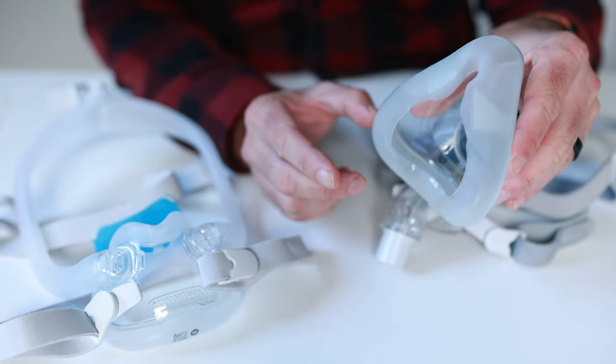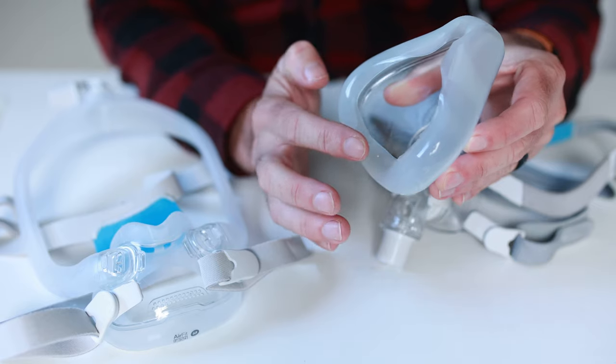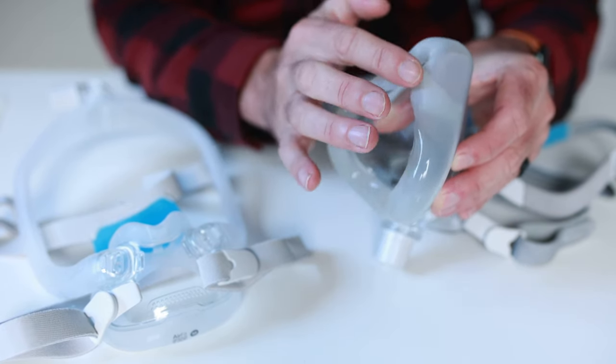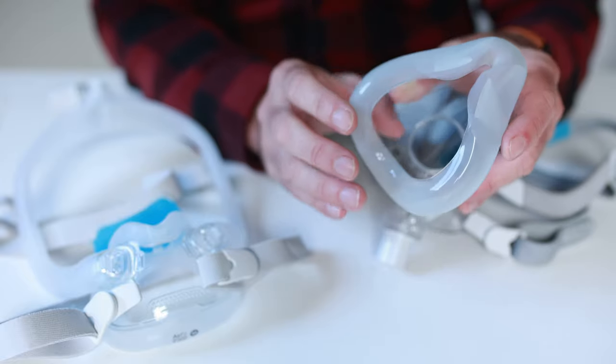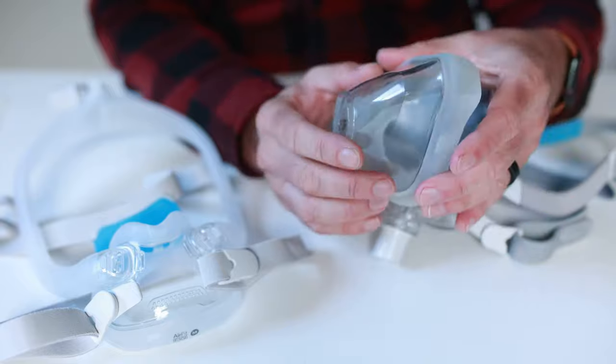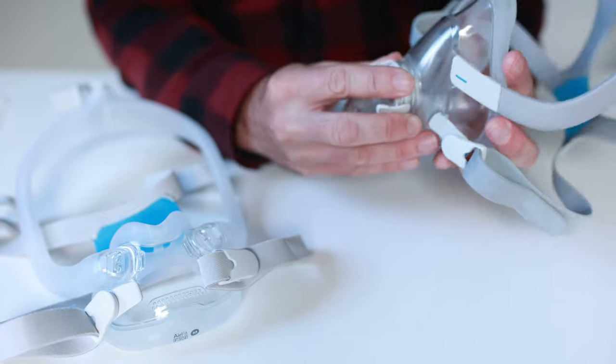This here is an F20 CPAP mask cushion by ResMed. It's prone to tears, especially in the thinner sections down the bottom here and also up here across the bridge of the nose. So grab yourself a spare cushion, put it in your top drawer, so when it does happen you can easily just grab it, put a new cushion in, and away you go.